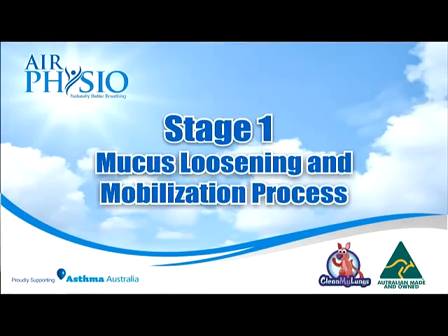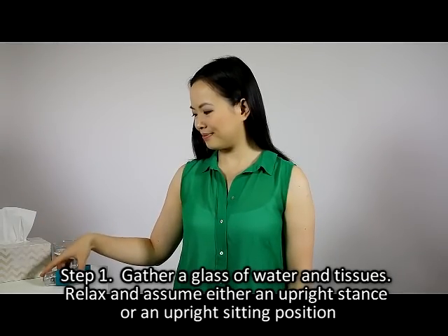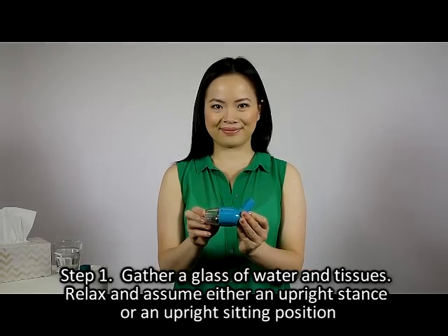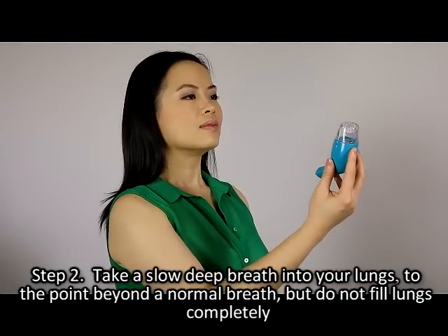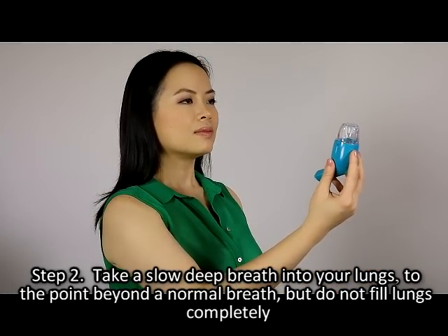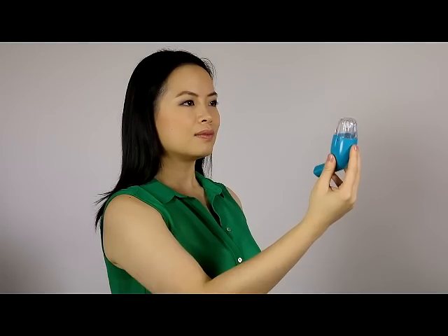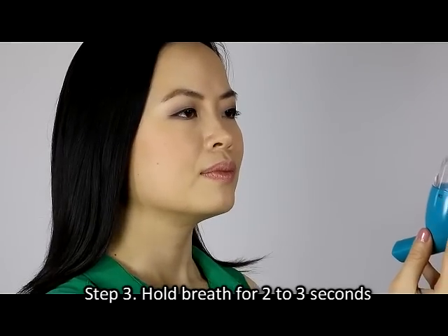Stage 1: Mucus loosening and mobilization process. Step 1: Gather a glass of water and tissues, relax, and assume either an upright stance or an upright sitting position. Step 2: Take a slow, deep breath into your lungs to the point beyond a normal breath, but do not fill your lungs completely. Step 3: Hold your breath for 2 to 3 seconds.